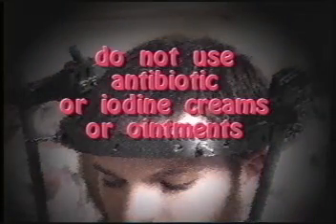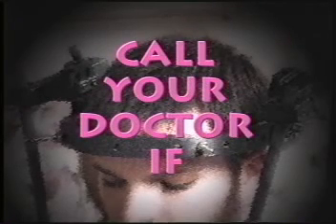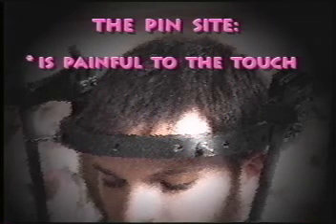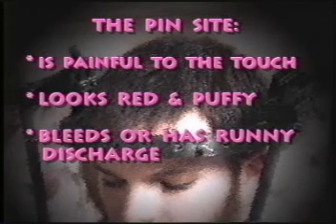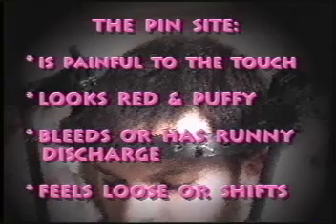Use a fresh swab on each pin site. Use another fresh swab to dry around each pin site. It is normal for the cleaning to be uncomfortable for the first few days, but within a week it will feel more like a tingle or a tickle. Do not use antibiotic or iodine creams or ointments unless your doctor tells you to. Call your doctor if you have any of these signs of infection: the pin site is painful to the touch, it looks red and puffy, it bleeds or has a runny discharge, or a pin feels loose or shifts.